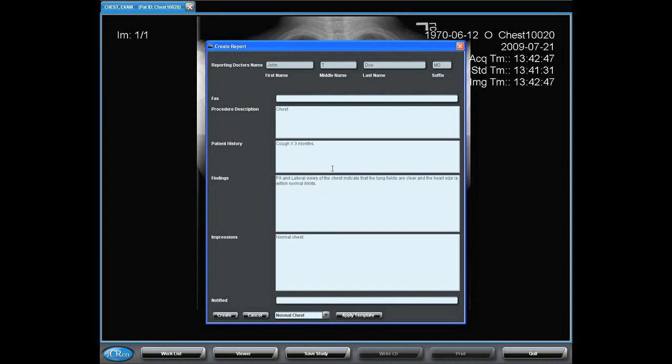That's going to populate my report with text that can be now added to or changed. Indicate the fax number and whether or not I've notified the doctor, the body of the report.